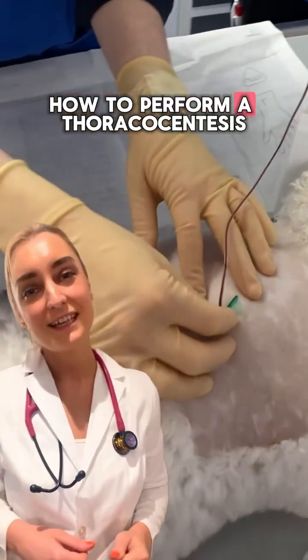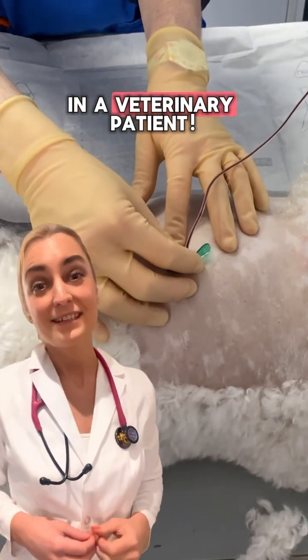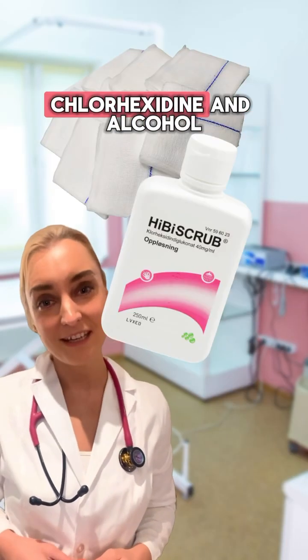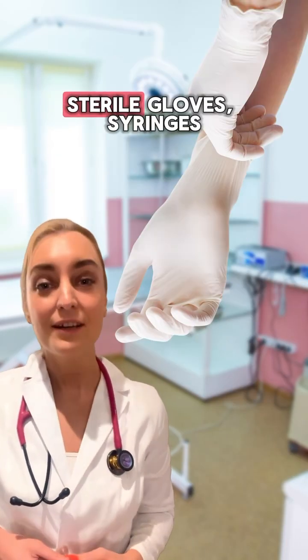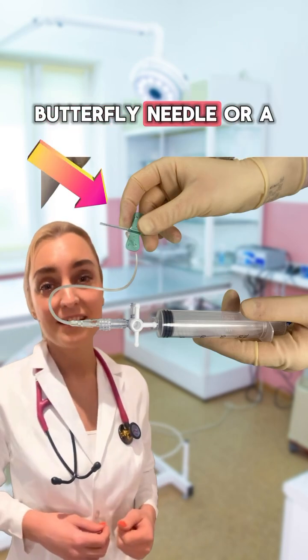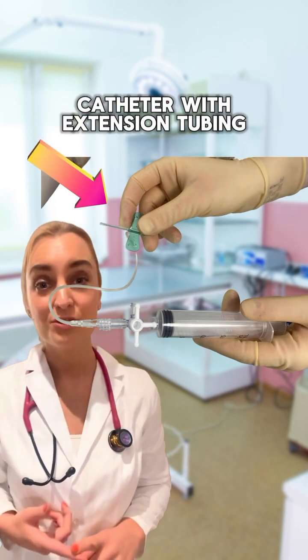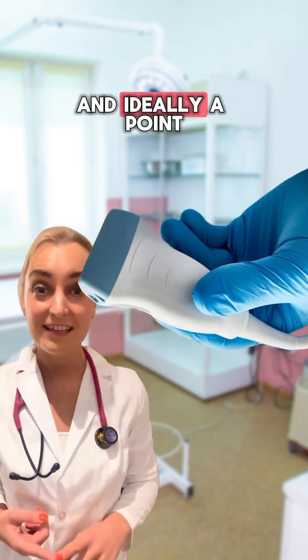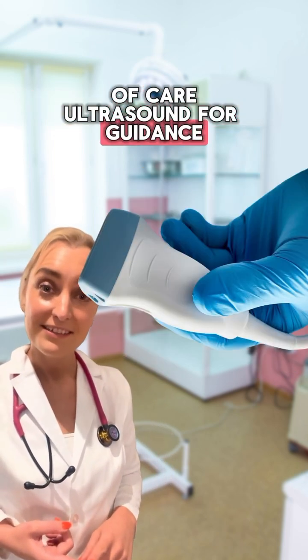How to perform a thoracocentesis in a veterinary patient. You'll need lidocaine, clippers, chlorhexidine and alcohol, sterile gloves, syringes, a three-way stopcock, a butterfly needle or a catheter with extension tubing, collection tubes for fluid samples, and ideally a point-of-care ultrasound for guidance.